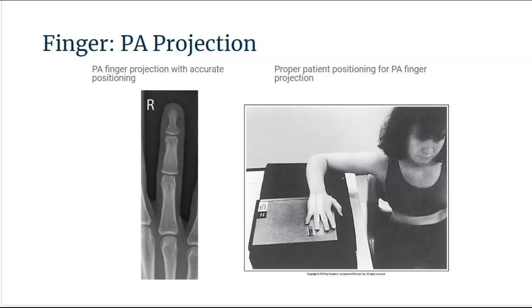Image analysis guidelines for the PA finger projection state that the soft tissue width and mid-shaft concavity should be equal on both sides of the phalange. There should be no soft tissue overlap from the adjacent digits.